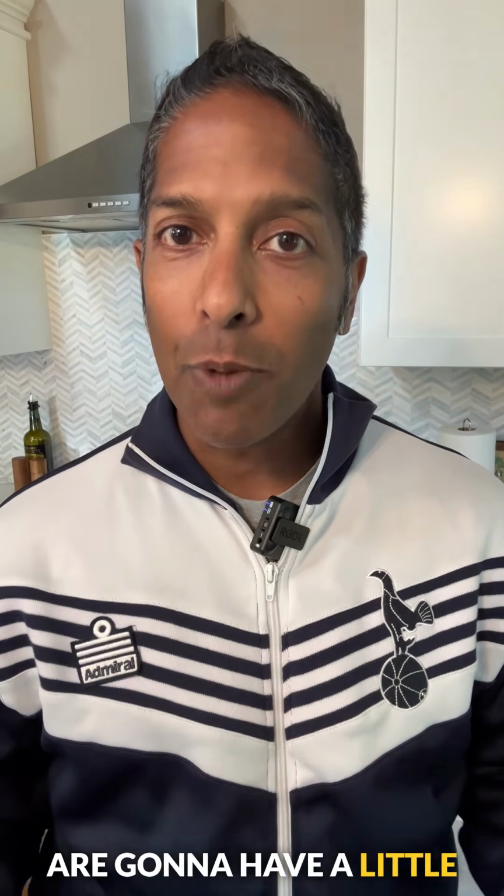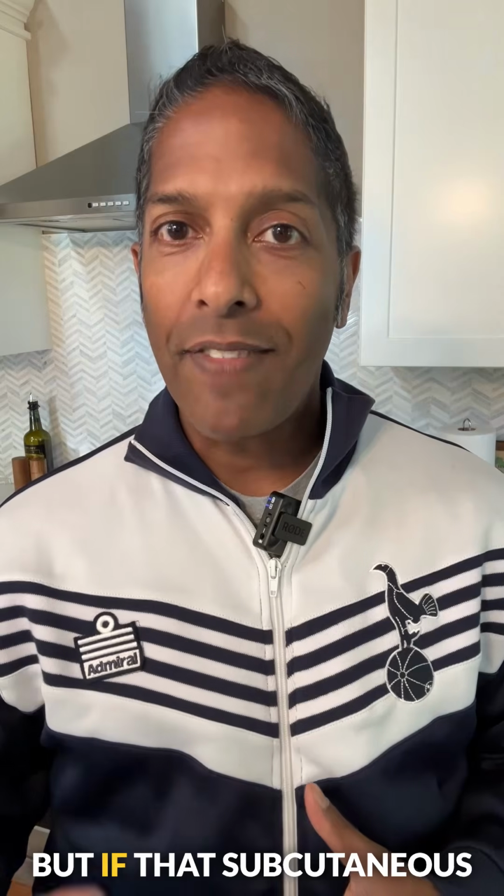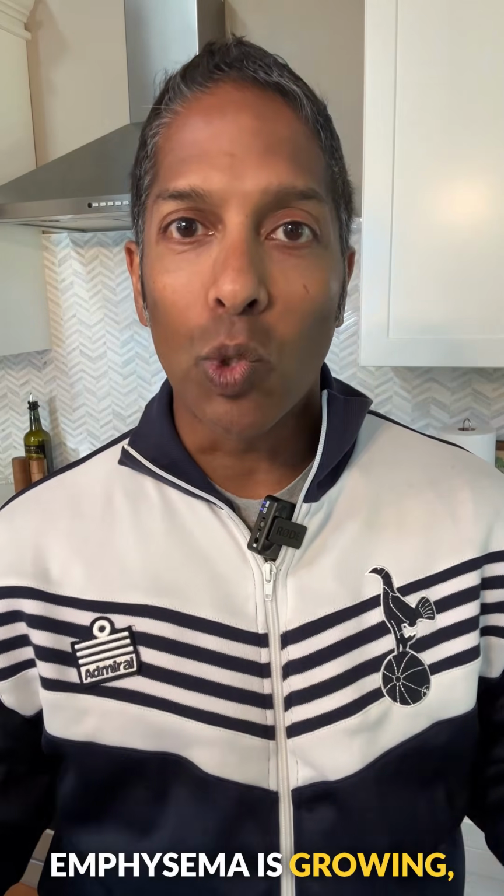And then finally, number three is to look for sub-Q emphysema. Most patients with trauma who have a pneumothorax are going to have a little bit of sub-Q emphysema. But if that subcutaneous emphysema is growing, if it's worsening after your chest tube placement, then you really have to question whether you've got one of the holes of that chest tube in the subcutaneous tissue. It's not actually in the chest.